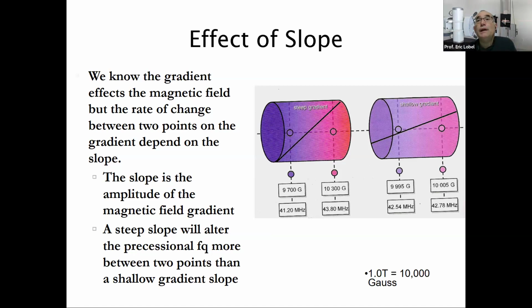And the frequency encoding gradient's slope will help us determine the bandwidth, right? In particular, the receiver bandwidth, what amount of frequencies we are accepting out of the patient, right? So slope has a factor in all 3 types of encoding, right? We're going to see it again in slice, phase encoding, and in frequency encoding.